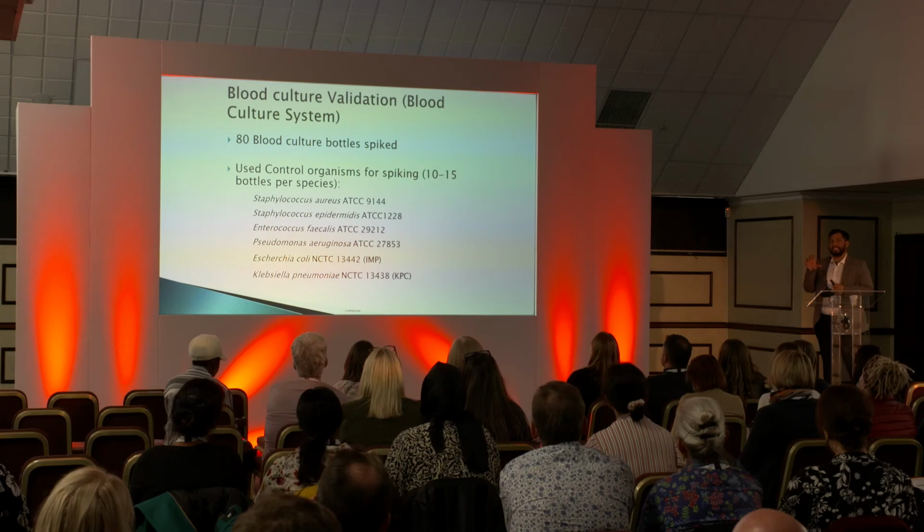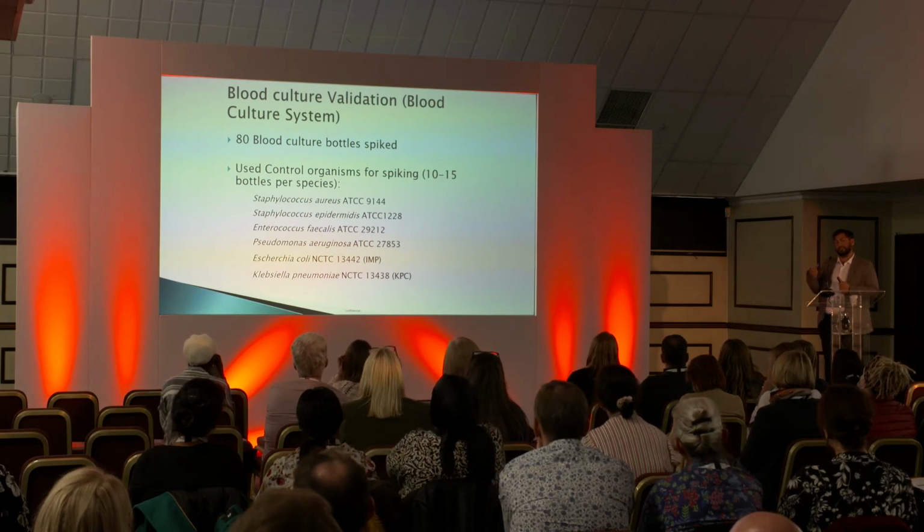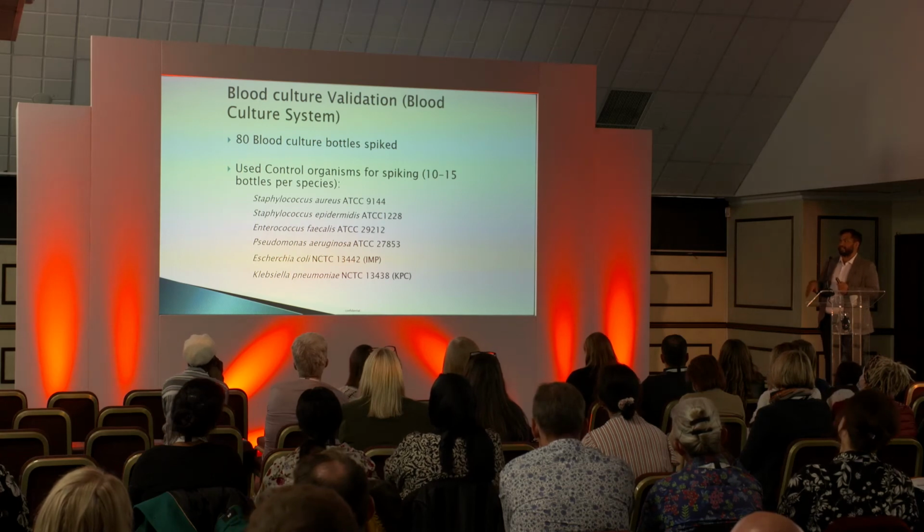While we were validating our blood culture instrument, we did about 80 blood culture bottles, which we spiked with organisms we have in the lab and tested. They all flagged up positive. So we tested an array of different organisms that are listed here.